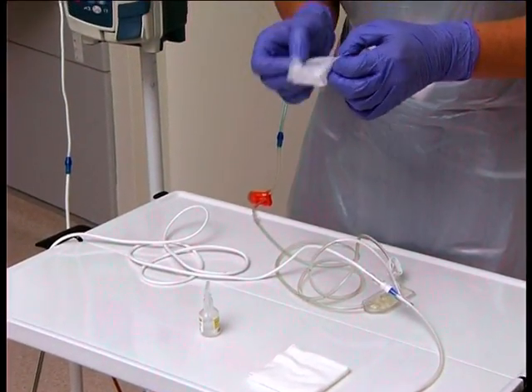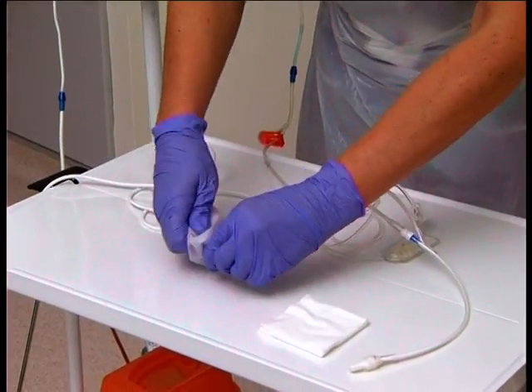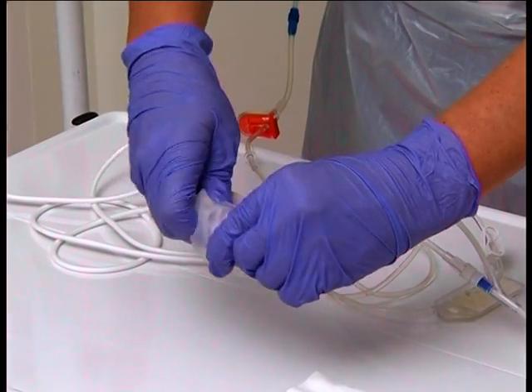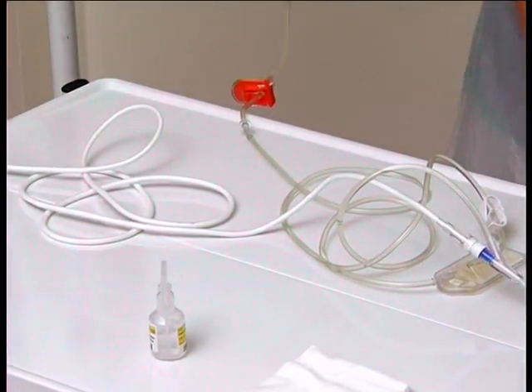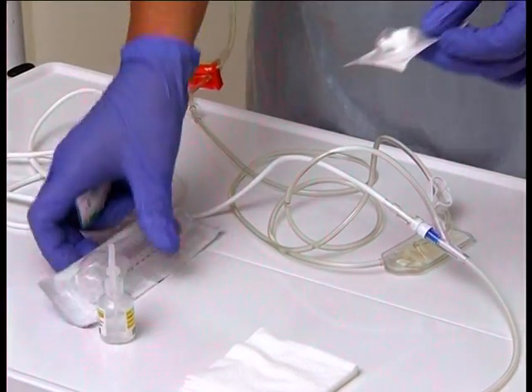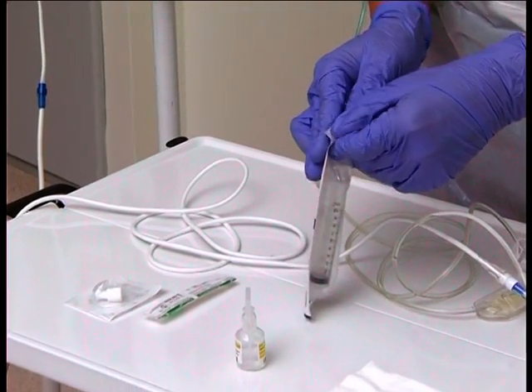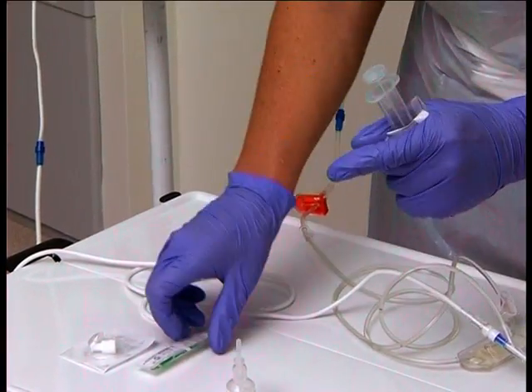Clean the neck of the 0.9% sodium chloride ampoule at the point where it will break, using a CHG wipe for 10 to 15 seconds. Put the vial onto the top of the trolley without touching the key part that you have cleaned. Leave this to air dry for at least 30 seconds, and longer if it still looks wet, so that any bacteria are killed. Open the 10 ml syringe packaging by peeling apart from the plunger end to approximately halfway.